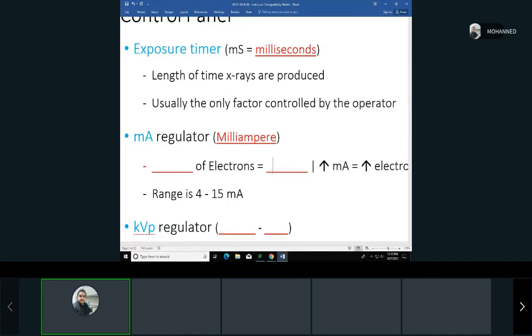I think in other countries it's 220, right? It's just the electricity that we get from the sockets. So it's usually 110, and I think it's 220 if you have a stove or something like that, or an AC unit. It requires more voltage.